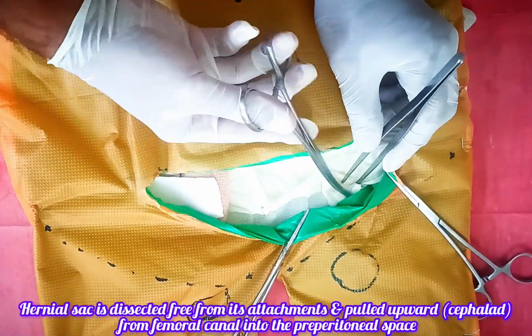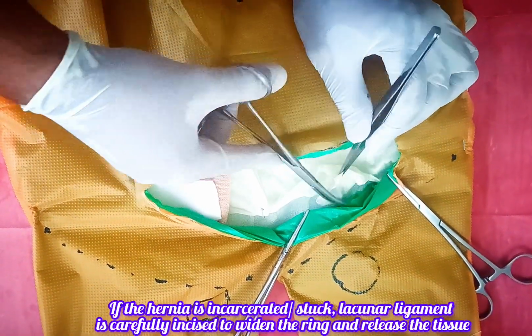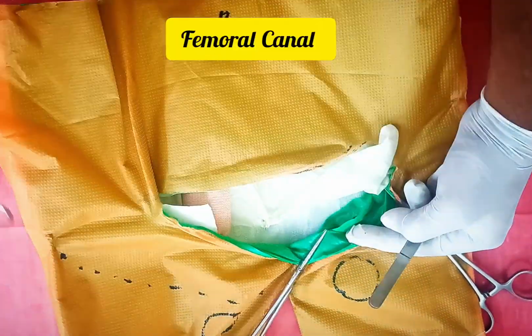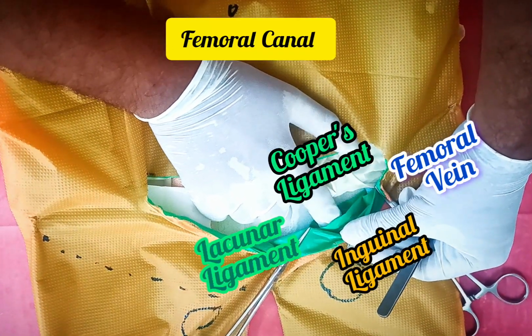Hernial sac is dissected free from its attachments and pulled upwards from femoral canal into the preperitoneal space. If the hernia is incarcerated or stuck, lacunar ligament is carefully incised to widen the ring and release the tissue. We can clearly see the femoral canal bounded laterally by femoral vein, anteriorly by inguinal ligament, medially by lacunar ligament, and posteriorly by iliopectineal ligament of Cooper.